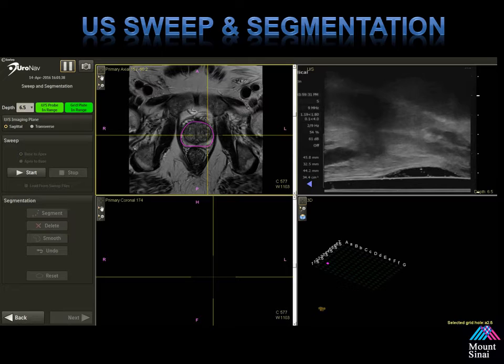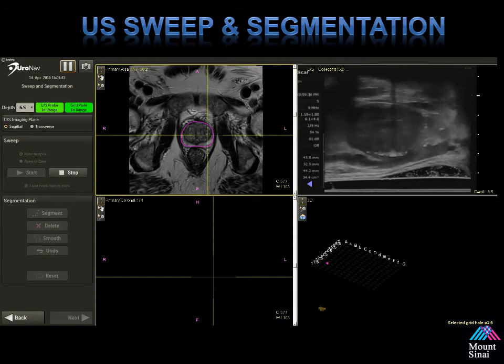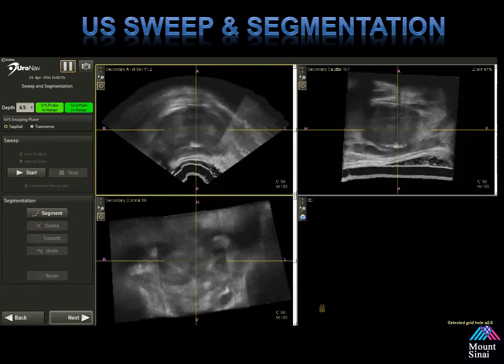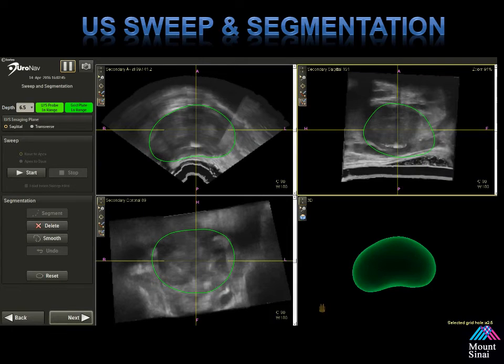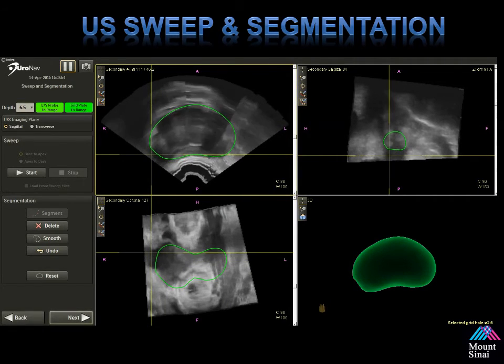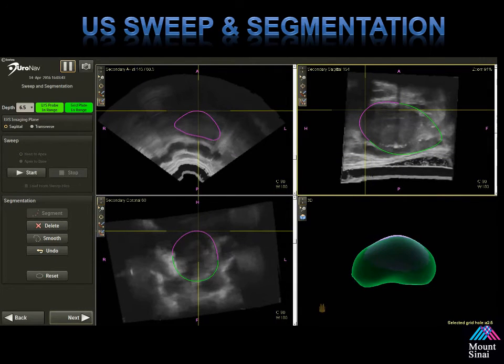For the ultrasound sweep and segmentation: with depth set and in the sagittal plane, slowly and evenly sweep through the prostate, capturing the ultrasound image in the upper right-hand corner of the screen. Note there's a large bulge of jelly within the rectum — we placed about 60 cc's of ultrasound jelly in the rectum before inserting the probe, but we're still able to visualize those areas. In the left upper-hand corner screen, select anterior, posterior, right, and left, then select apex and base in the right upper corner screens, and click segment. This builds a 3D ultrasound model used to align the ultrasound to the MRI volume. Scroll through back and forth, making small adjustments to ensure the best possible contour. You're able to see this in multiple planes — when you move something in the left upper screen, the right and lower left screens change accordingly to create the best possible 3D ultrasound segmentation.